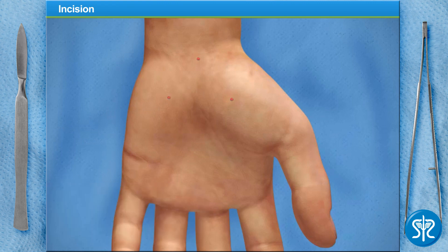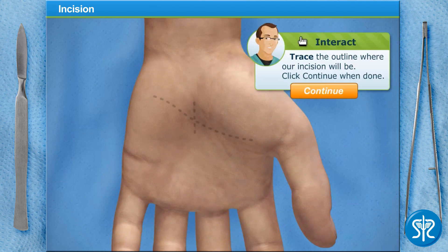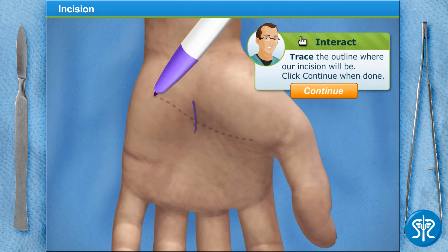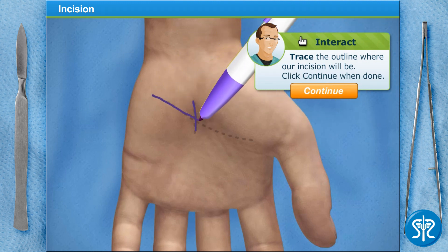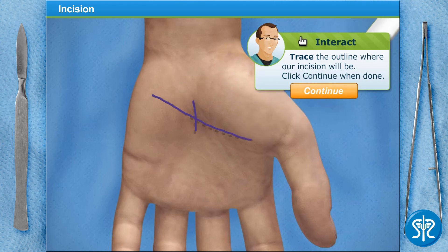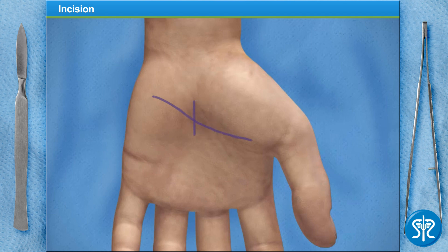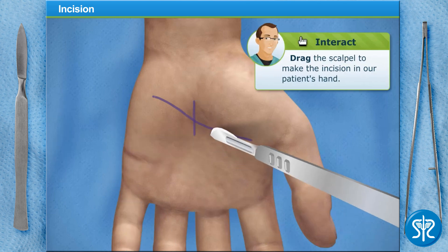With the wrist anesthetized, we can now begin the operation. I've already tied a tourniquet around the patient's upper arm. Can you go ahead and outline where we'll be making our incision? We'll be making a three-quarter inch incision at the intersection of those lines. Now take the scalpel and make the incision.